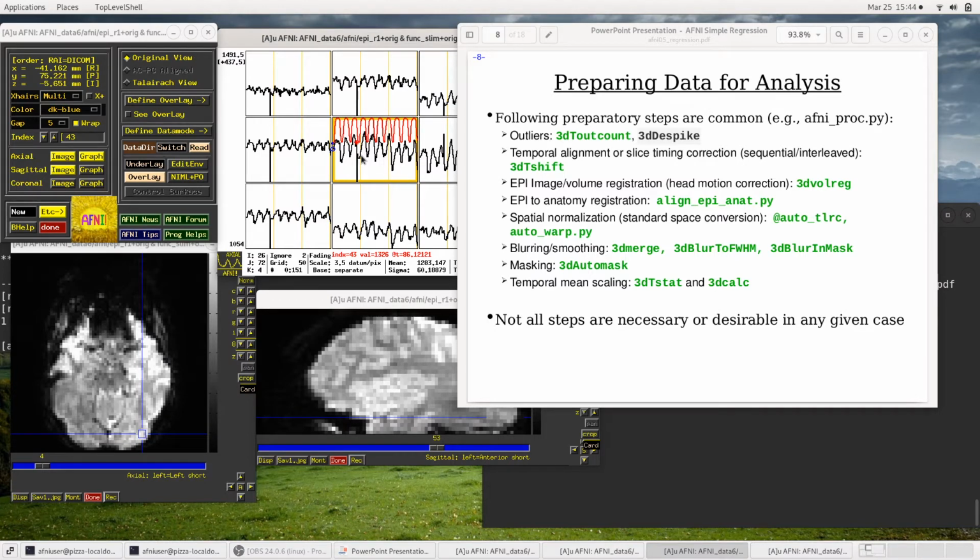But I believe it basically reduces being more than two median absolute deviations out, to an infinite number, say, down to the range of 2 to 4. So it just squeezes them down, and none of the spikes are too huge. Recall that a lot of the operations, even in the pre-processing and certainly in the regression, you care about least squares of differences, and so spikes really kind of mess things up. So there is some good use in running a despike operation.